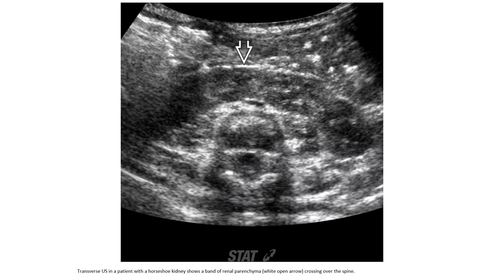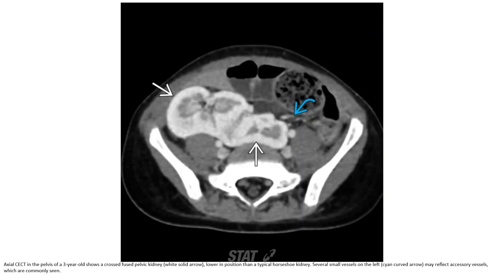Ultrasound of the patient with a horseshoe kidney shows a band of renal parenchyma crossing over the spine. Contrast imaging in a three-year-old shows a crossed pelvic kidney, lower in position than a typical horseshoe kidney. Several small vessels on the left may reflect accessory renal vessels, which are commonly seen.